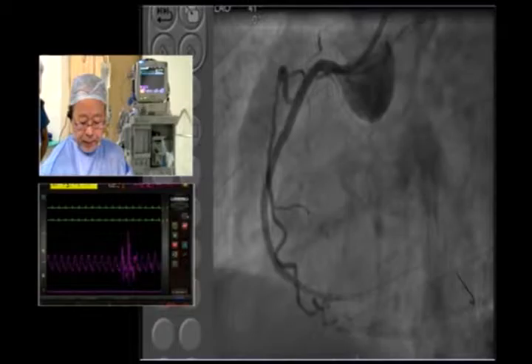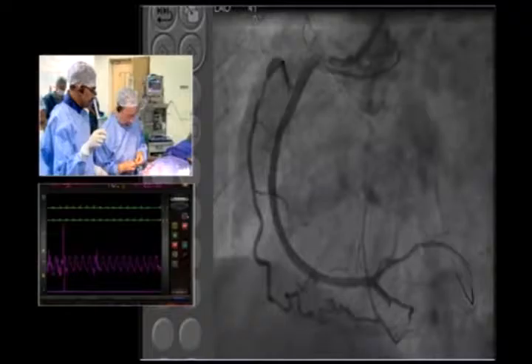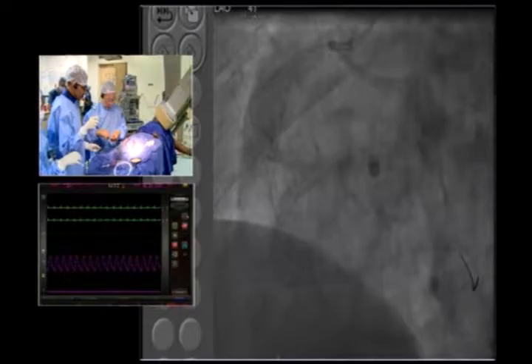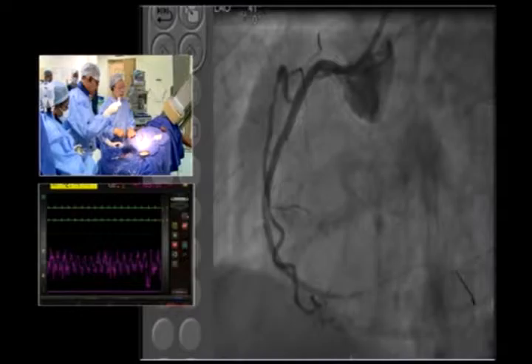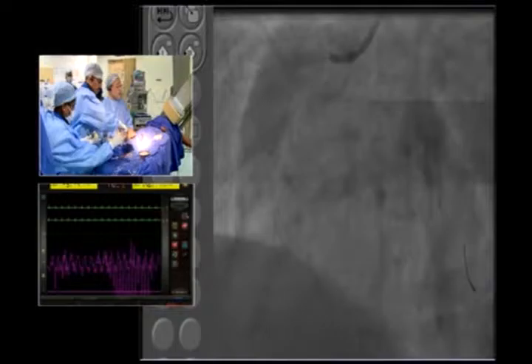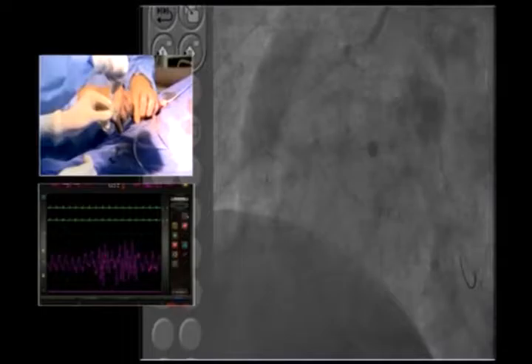So this was the stent implantation by using 14 atmospheres. Okay, and next we do 3.5 postdilatation. Looks beautiful. This is 3.5 millimeter. And now I am taking a 3.5 millimeter high pressure balloon to postdilate this long stent. I think this is a very long stent, so the postdilatation is much more important. The proximal is almost 4.0.